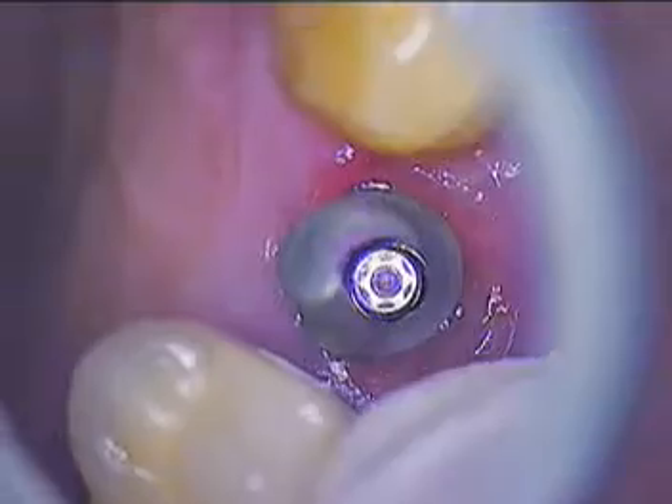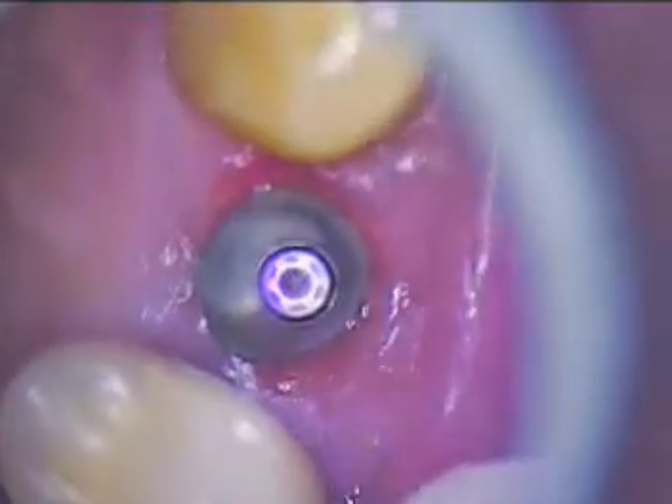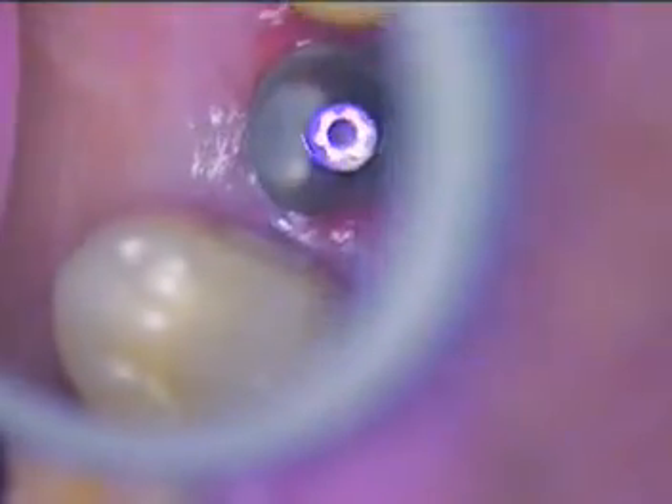We're going to push the abutment into place — there it is, our customized abutment. That follows the soft tissue nicely. Then we'll hand tighten that first, and try in our crown.